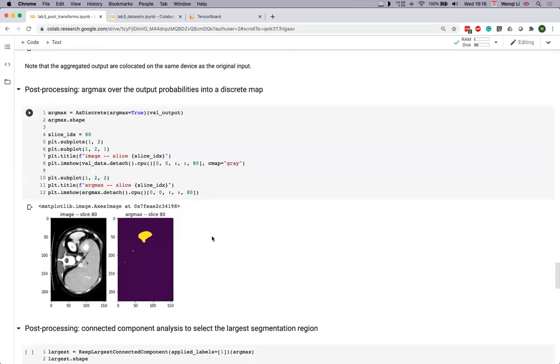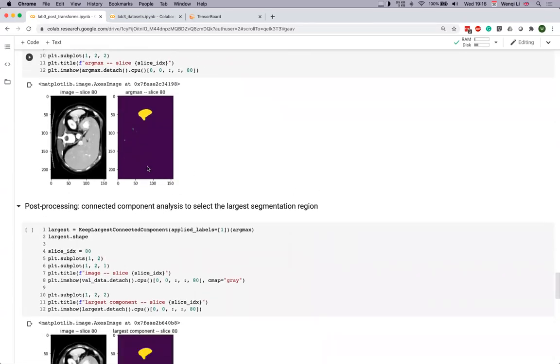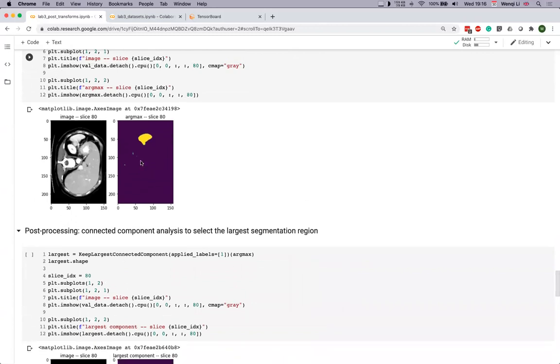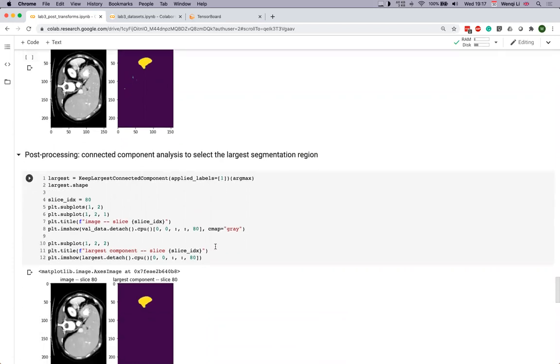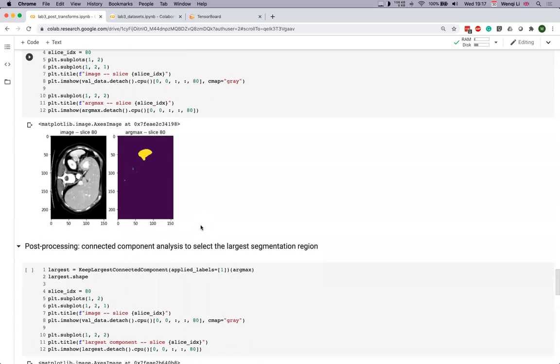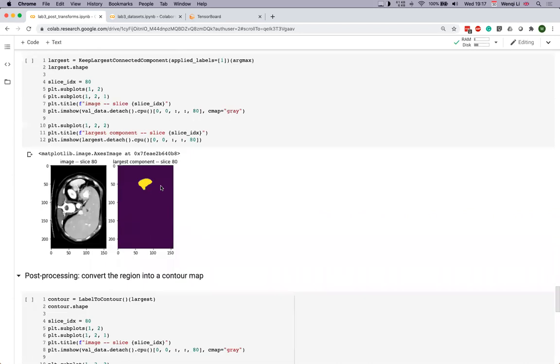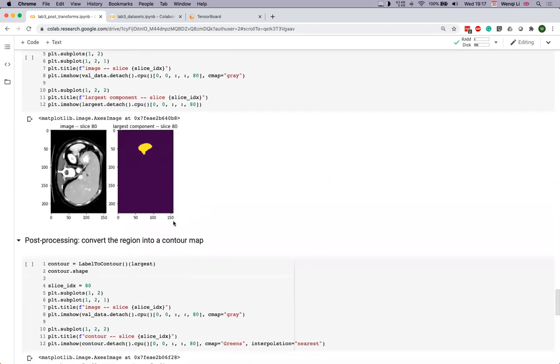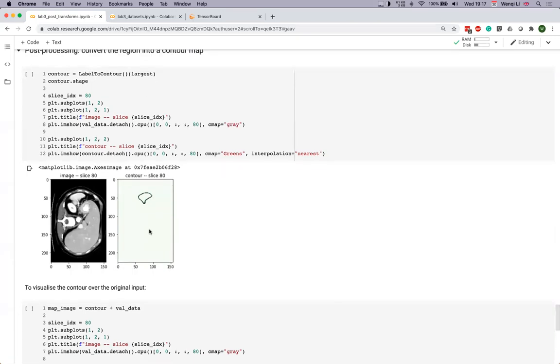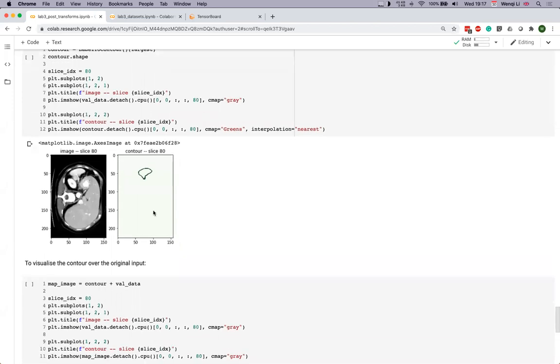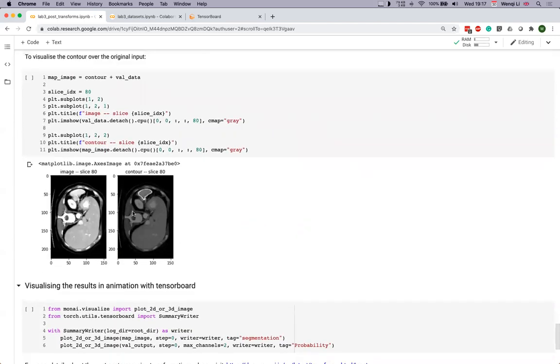We also demonstrate a few post-processing transforms to remove noisy segmentation results. Because the model was only trained for 30 epochs rather than the ideal 600, it produces imperfect segmentations. We use connected component analysis — one of the transforms in MONAI — to identify the major region, and can also detect contours to show boundary regions. These can be visualized together with the original image.